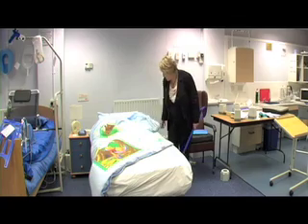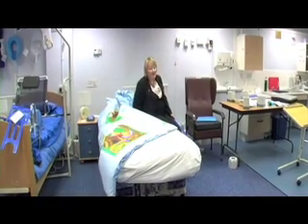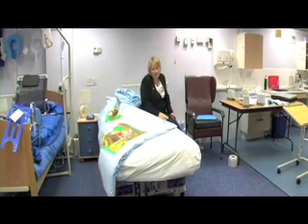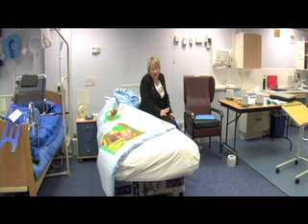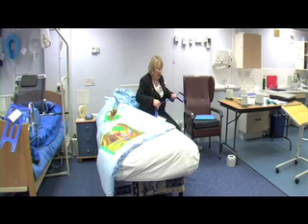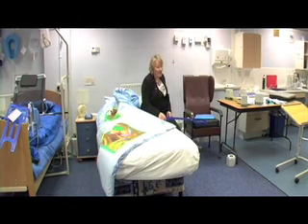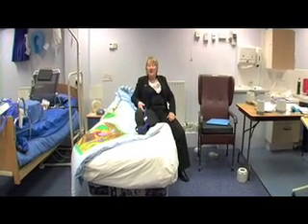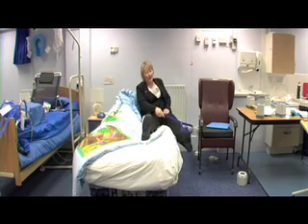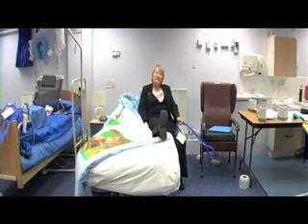Often what people have problems with is that they sit on the bed and then they can't get their legs up. And often the reason for that is, as I said, poor abdominal tone, and also the legs. Perhaps their legs have just got heavy and they're just getting older. One of the things that you can use is something called a leg loop, and that helps somebody actually lift their leg up. So somebody can do that, 1, 2, and I help that along. They won't need it for getting out of bed because they use gravity to get out of bed.